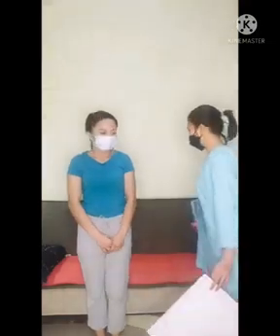So, the 11th projection that we're going to do is the hip AP projection. So, the patient is in supine position.